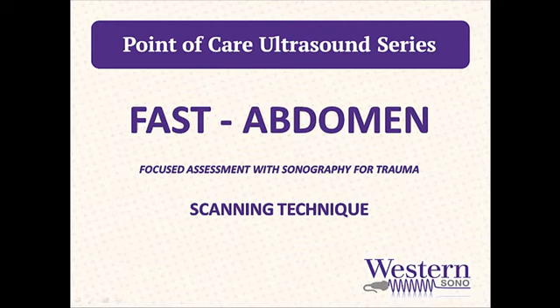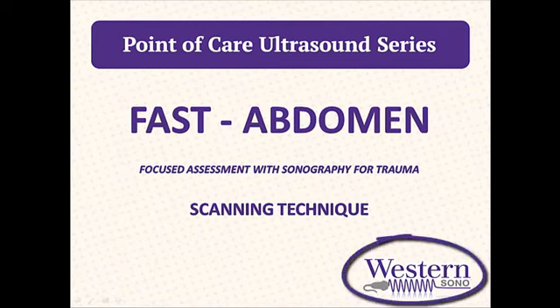The goal of this session is to review the scanning technique, image interpretation, and proper archiving for the abdominal component of the FAST exam. A subsequent screencast will provide a review of some of the pearls, pitfalls, and clinical applications of this study. And as always, please visit us at westernsono.ca for all of our updated ultrasound resources.